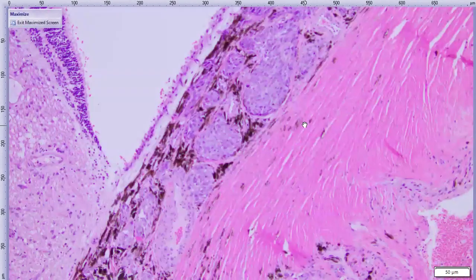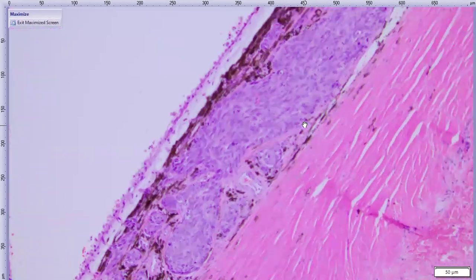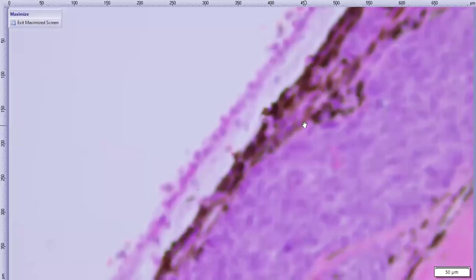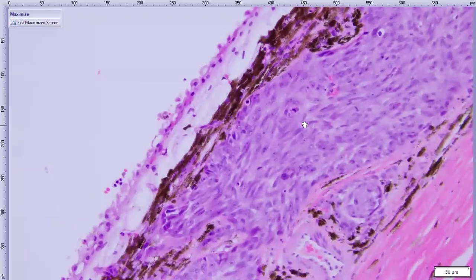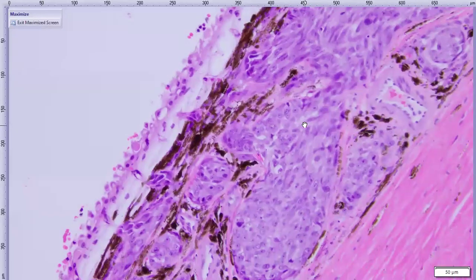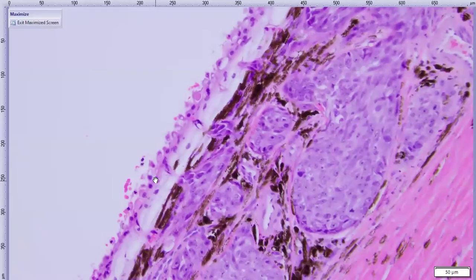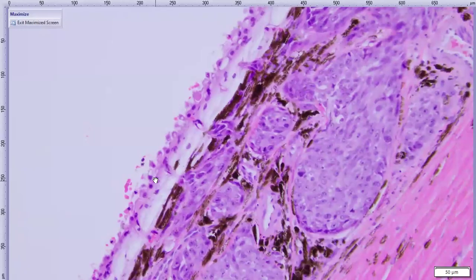I wanted to show one thing over here. One of the things that I thought was interesting is that you can see where I think neoplastic cells are coming right up into the choriocapillaris, which is the blood vessel bed that feeds basically the retina. They feed the retinal pigmented epithelium, which is what's here, because the retina is detached. So you can see those neoplastic cells moving right on up into that choriocapillaris.